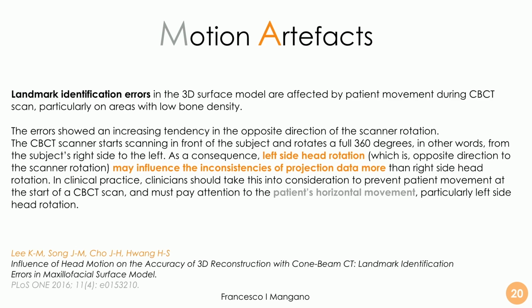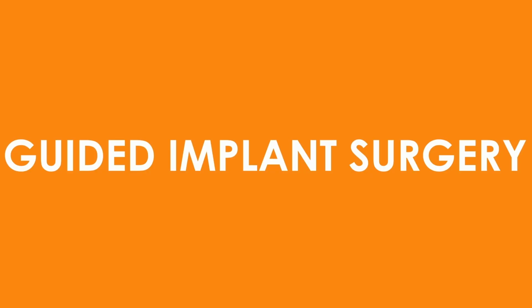This is interesting because, of course, with modern machines we can control the patient and the fact that the patient should be immobilized during the whole scan, but of course we can consider that if we have this kind of movement we can even have worse errors.